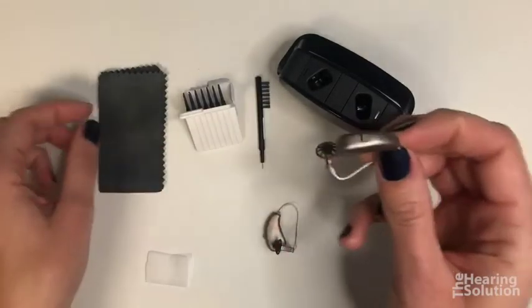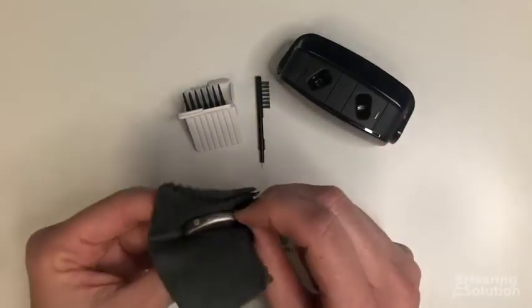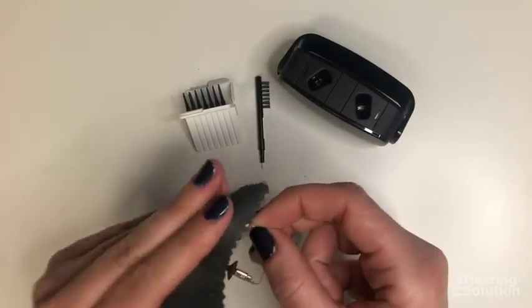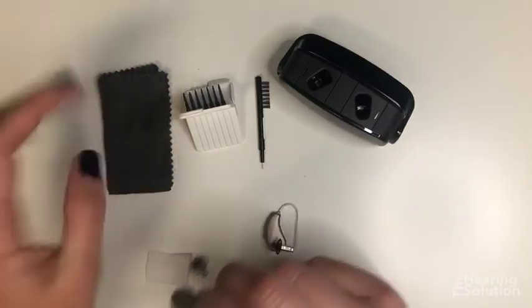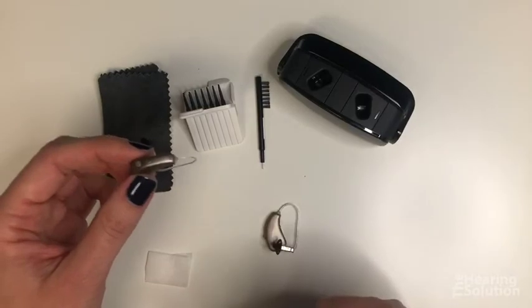The next step is to take the dry cloth and wipe down the back of the hearing aid to remove any oil, dirt, or debris. That way nothing is blocking the charging system and your charger will stay functioning properly.